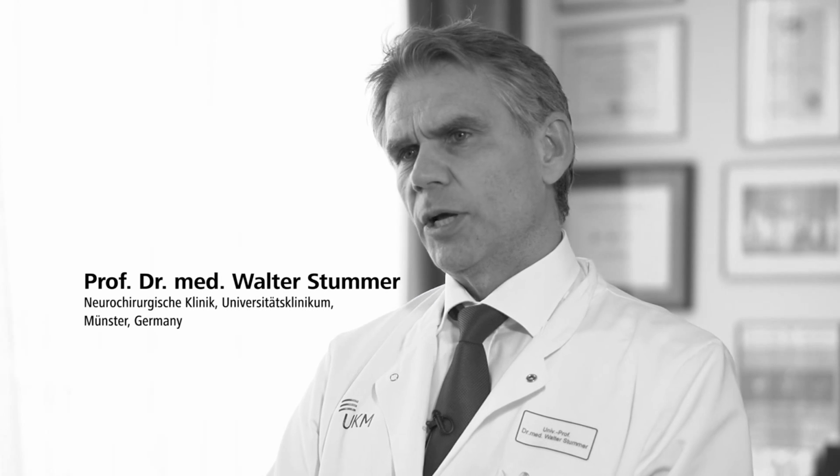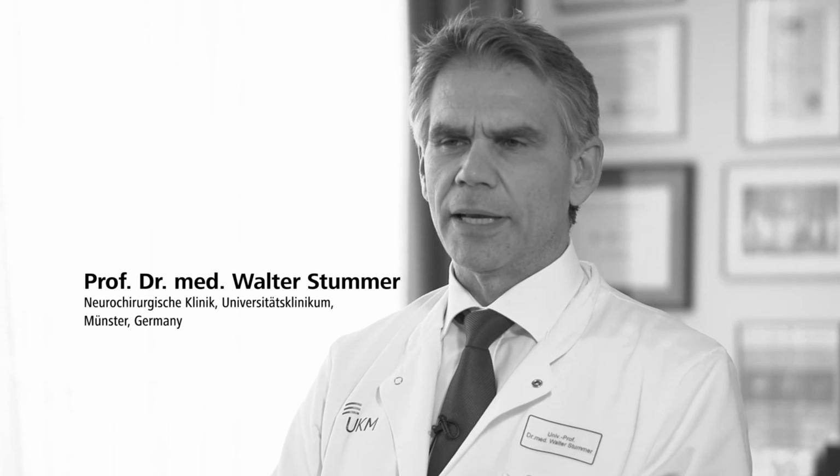Flow 800 is an important visualization analysis tool in AVM surgery because it helps us very rapidly to understand the hemodynamics behind an AVM. We can rapidly identify the feeders, we can rapidly identify the drainers, and then while we're doing surgery there is a way of staged assessment of how good or how bad perfusion is in the brain. I've been working with Flow 800 for several years now, and it's a good adjunct to the infrared 800 actually during vascular surgery. I think it's become quite indispensable.